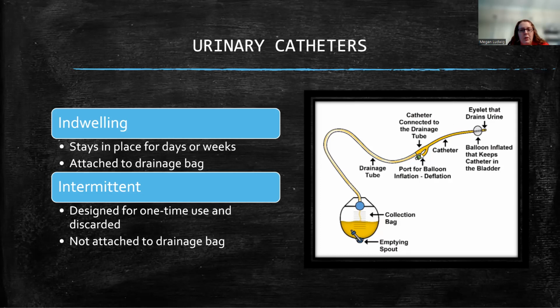Okay. So you inflate the balloon with sterile water because saline can kind of break down sometimes, it's latex. You can have latex free, but it should be sterile water. And if it's a 10 or a 5 cc balloon, it's a 10 cc syringe. You need 5 cc's in the tubing and 5 cc's to inflate the balloon. So if you only had 5, the fluid would only get pushed halfway and wouldn't inflate the balloon all the way. So you need a little bit more than what the balloon actually is.